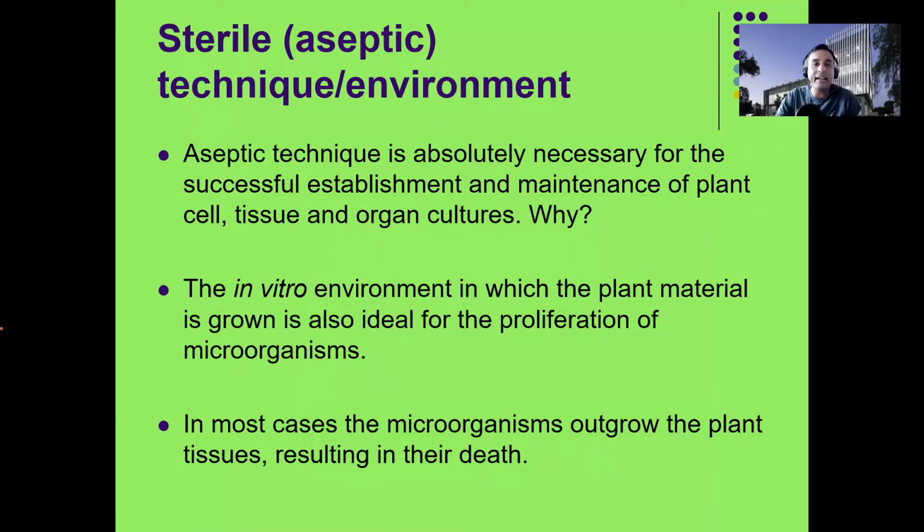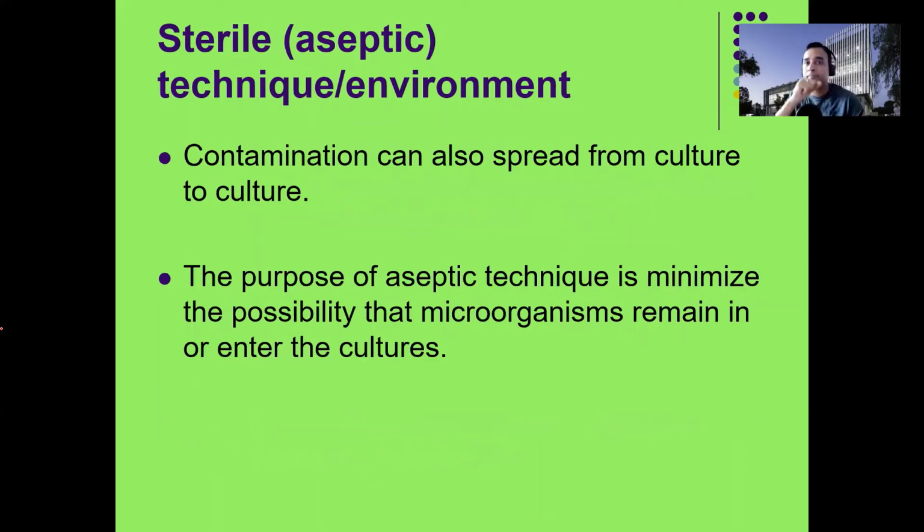Sterile condition or aseptic condition means a condition where you don't have any kind of microorganism, free from life. Okay, so that is called aseptic condition. Contamination, as I already mentioned, has two main sources, internal and external, right? Internal can be cleaned, can be treated, can be sterilized, but it also depends on your good practices. But external: if you have a very clean explant, very clean conditions in the media, everything sterilized correctly, but your external handling, how you handle the media, you will contaminate it.